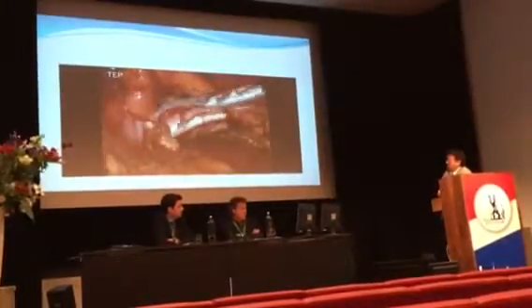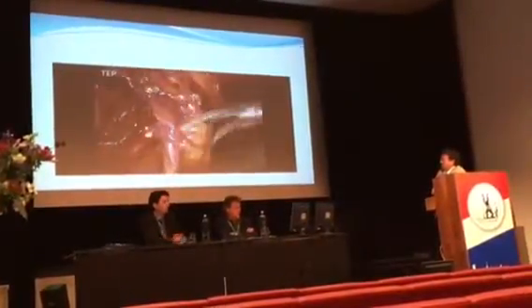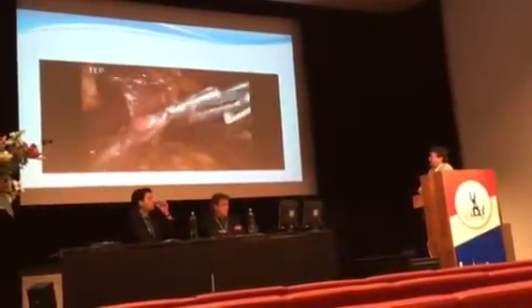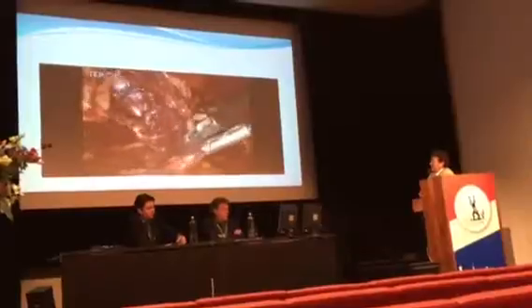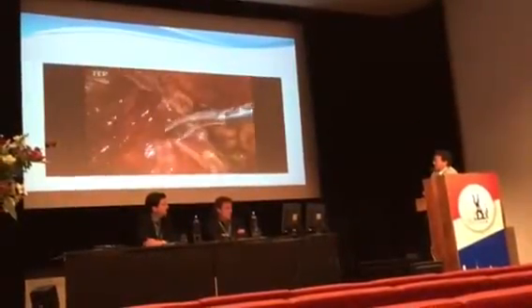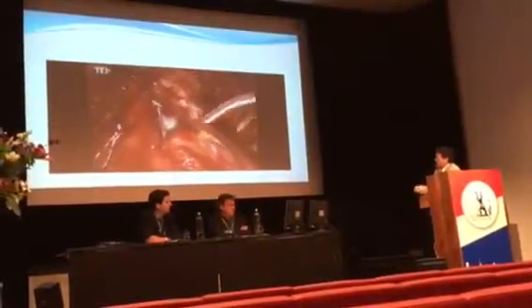You dissect this huge sac, which is also difficult because large sacs cause some decrease of peritoneal space due to chronic adhesions and so on. This is the huge sac here.